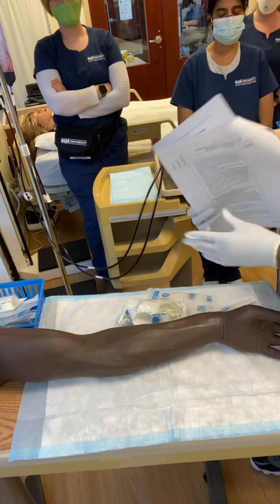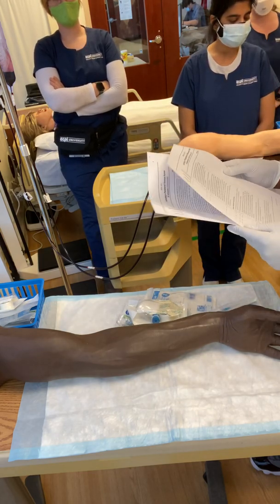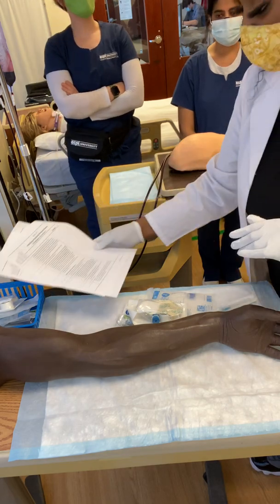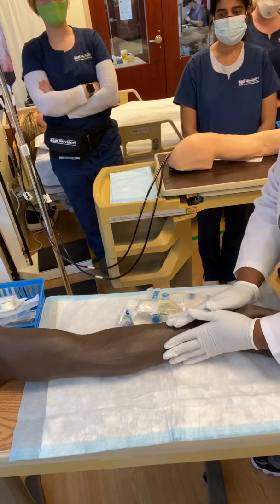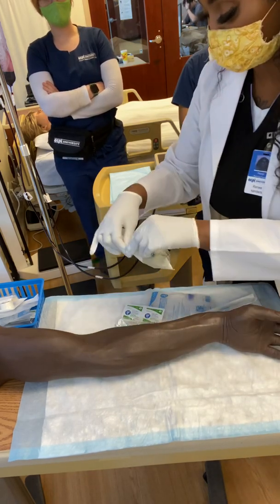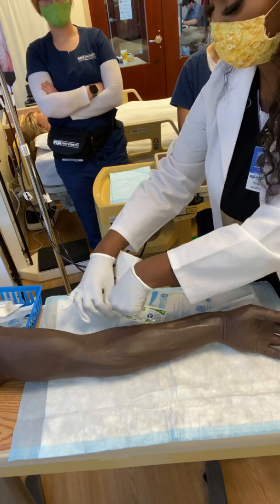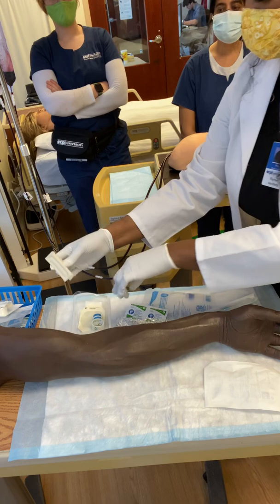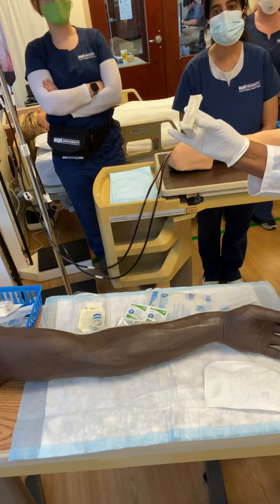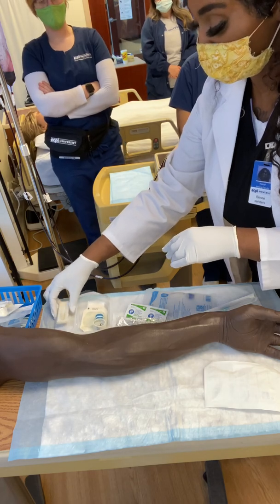All right, so let's see. We want to start over here. Okay, so anyway, we're going to select. We're going to see the side. Okay, we're going to use this arm. So now we're going to go ahead and assemble everything and get everything ready, okay? So we're going to open our packet. We're going to be careful. We're going to go ahead and pop our alcohol, okay? That way we can get it ready and nicely activated.